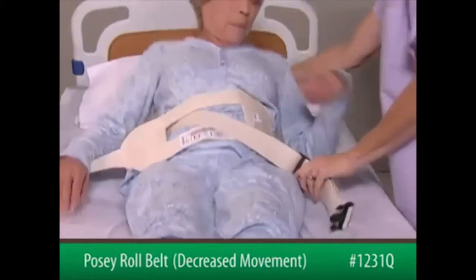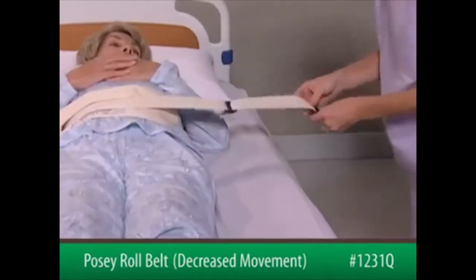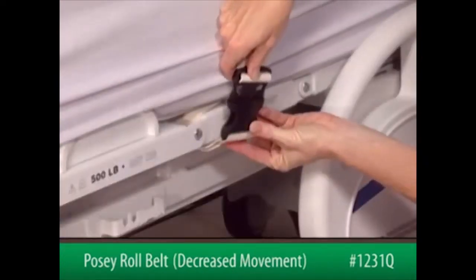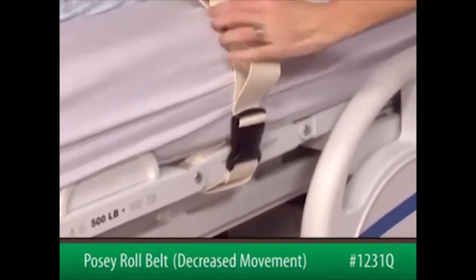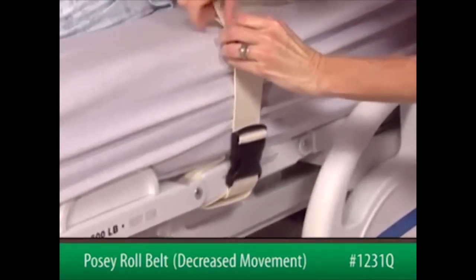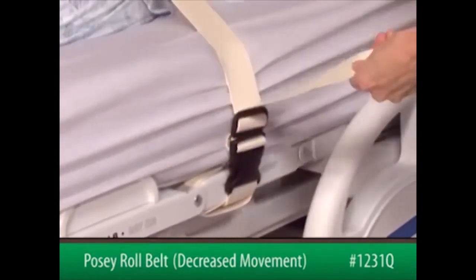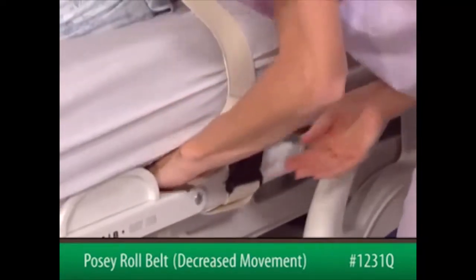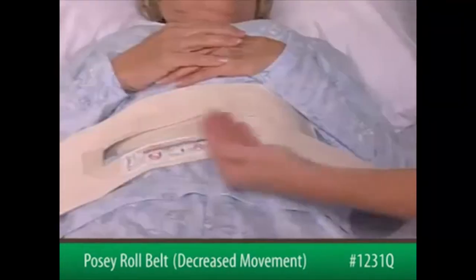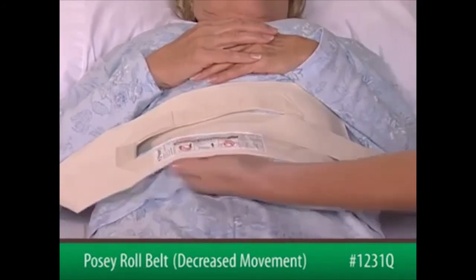Position the patient in the bed. Now, insert the male end of the connecting strap into the female end of the short strap. Pull on the top strap to adjust the slack and move the slide buckle down to the quick-release buckle. Take any excess strap out of the patient's reach. After securing both sides to the bed frame, slide an open hand, flat, between the device and the patient to ensure proper fit.